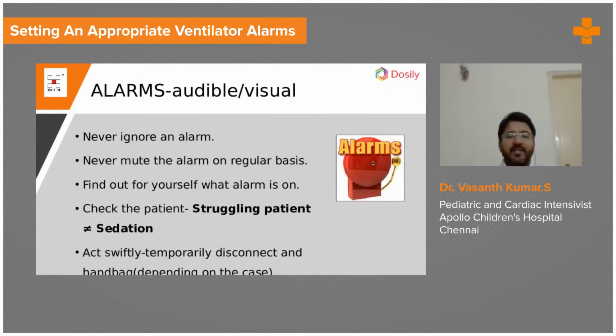So 3 parts have been covered. Now we are entering into the last part of the session, which is alarms. Whenever you enter into an ICU, you always keep listening to this tick, tick, tick, tick, that alarm sound. That is the one which gives you a feel that you are in the ICU.